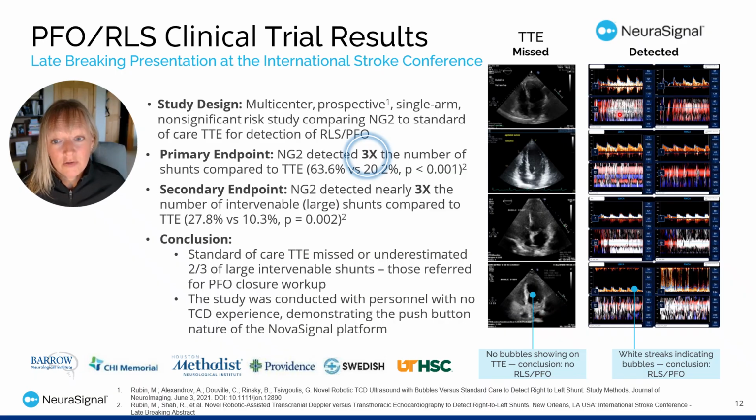And you can see all of the bubbles detected on neurosignal TCD systems here, these very severe high-grade shunts that were found and completely missed on TTE echo.